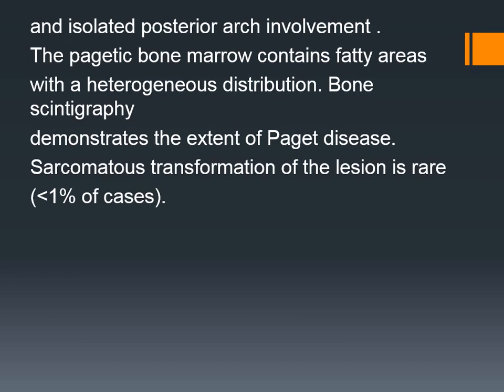The Pagetic bone marrow contains fatty areas with a heterogeneous distribution. Bone scintigraphy demonstrates the extent of Paget's disease. Sarcomatous transformation of the lesion is rare, less than 1% of cases. Osteosarcoma?